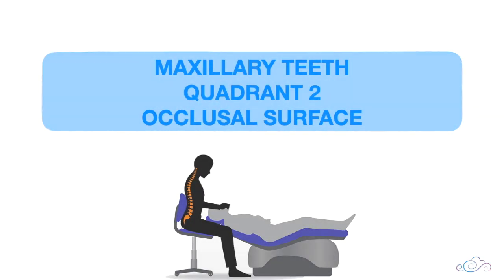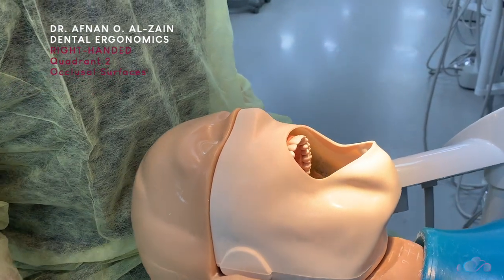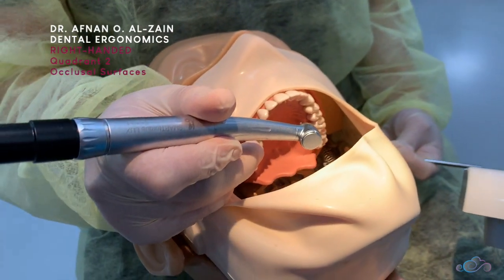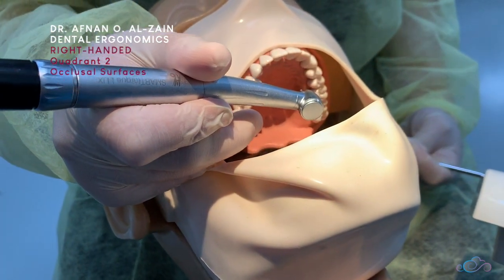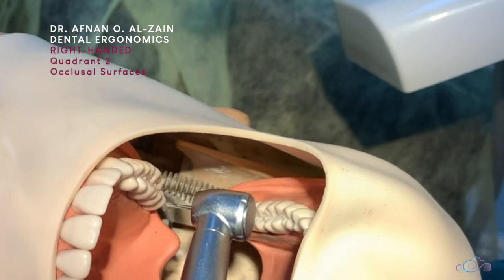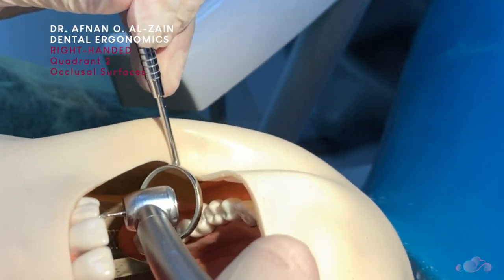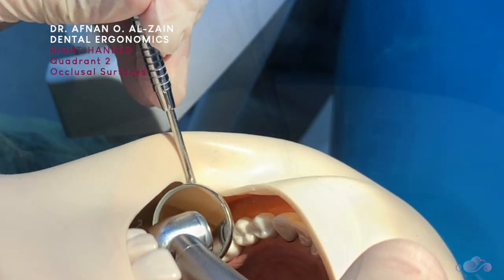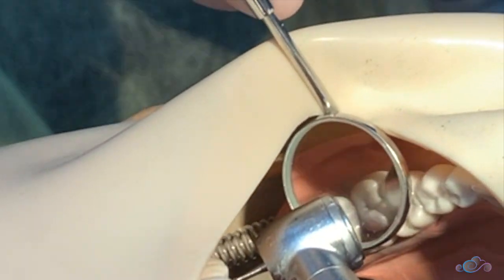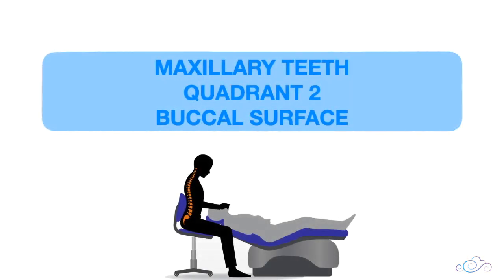Moving on to quadrant two — when working on the occlusal surfaces of the maxillary teeth. You're going to be behind the dummy head, place finger support on the right side, and extend the handpiece to the left side in quadrant two. Place the burr perpendicular to the surface and position the mirror at an angle until you can see the occlusal surfaces clearly.